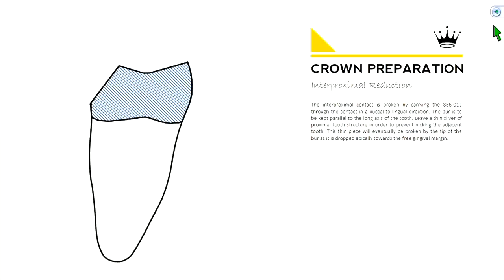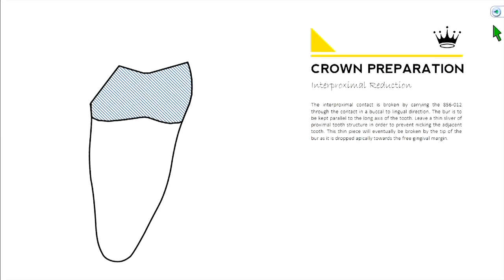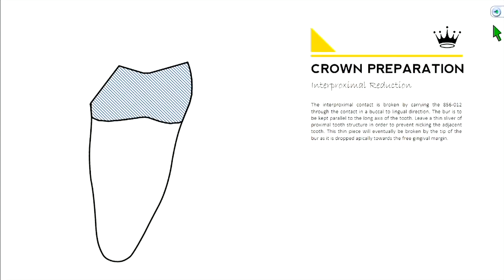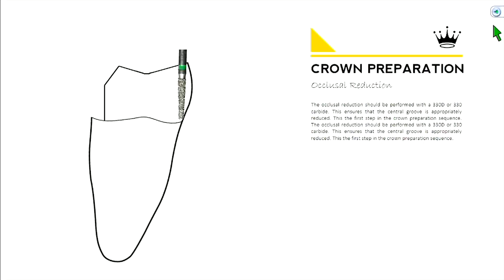Then you go in between — this view is from the mesial. You can't really see the interproximal reduction until we turn it sideways. So you go through interproximally and reduce that tooth structure. Then you jump to your buccal margin, where we want to put a 1.2 millimeter shoulder margin — a 90-degree margin — on that buccal surface. Then on the lingual we'll be a little more conservative, and we'll explain why in a bit.